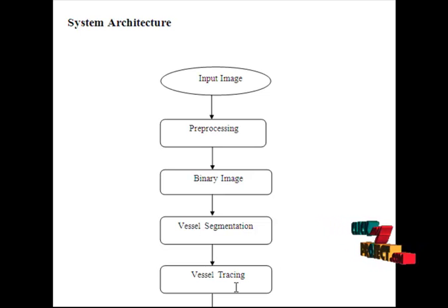The segmented vessel will be detected in the original image by the use of graph tracing algorithm. Each vessel is tracked individually by repeatedly finding the next vessel point with a sorting function that considers the pixel intensity and the orientation in the retinal image. Tracking for the same vessel then continues along the most likely path. Next, we model the segmented vessels as a segment graph and use constraint optimization to search for the best set of vessel trees from the graph.